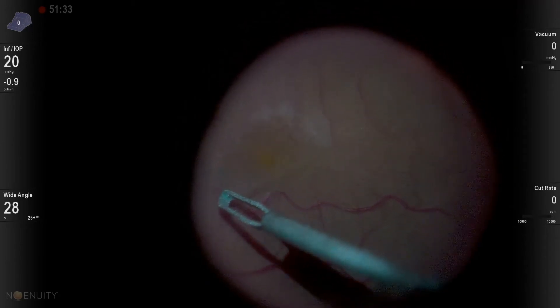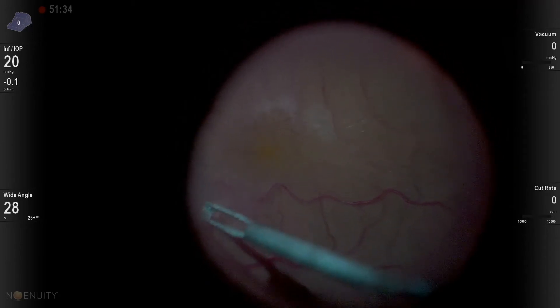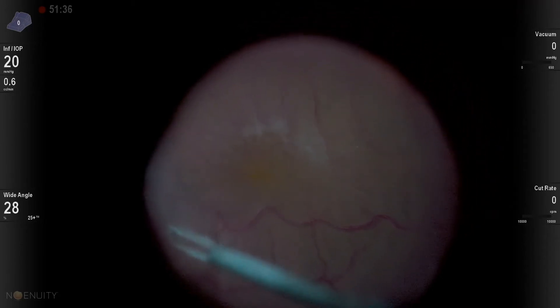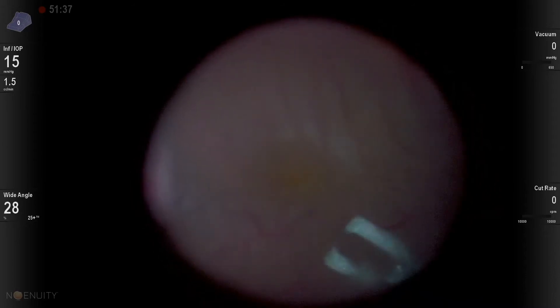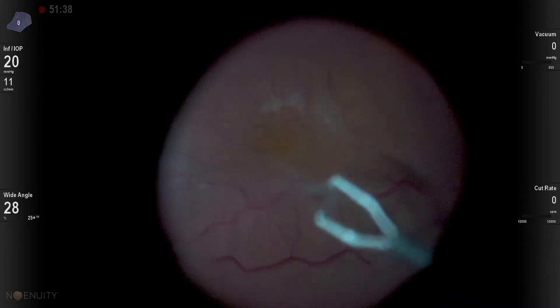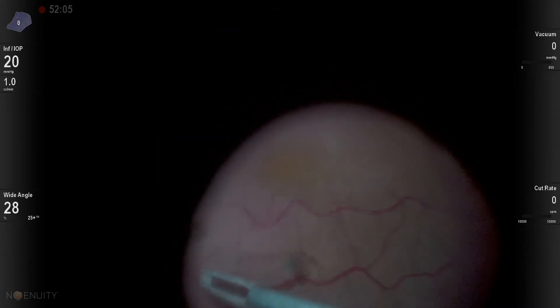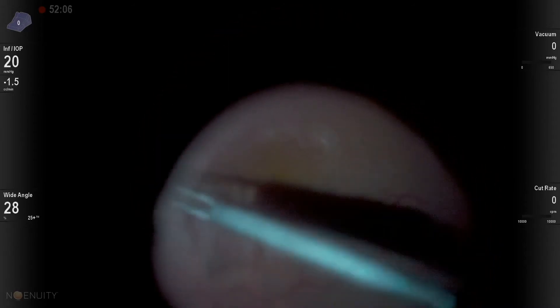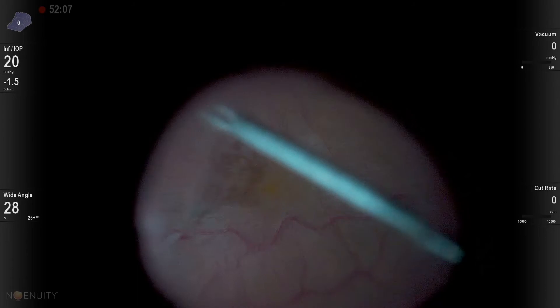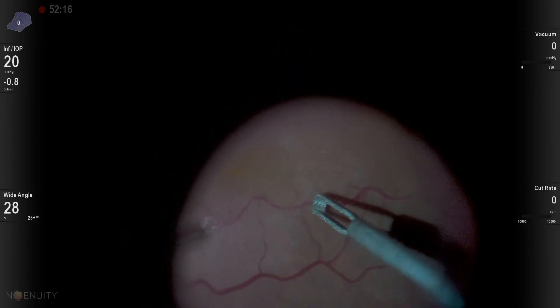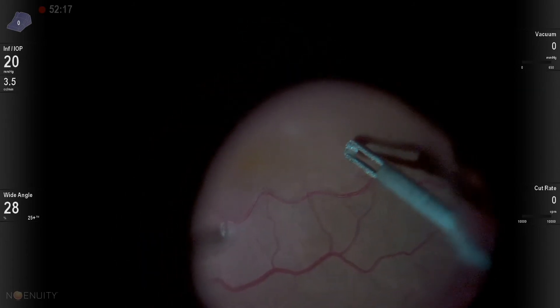Very light staining of the ILM and epiretinal membrane. And here you can see the epiretinal membrane with a good pinch and peel comes up nicely in about three or four pieces, really well here.